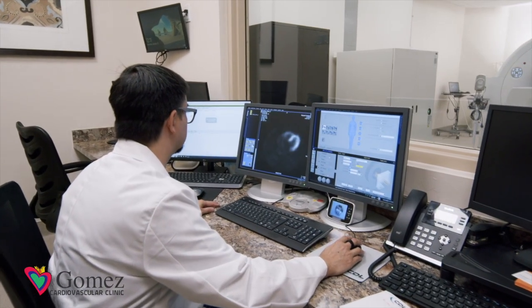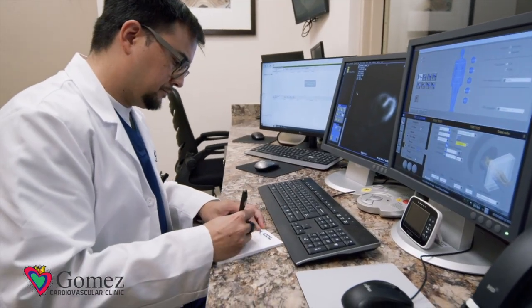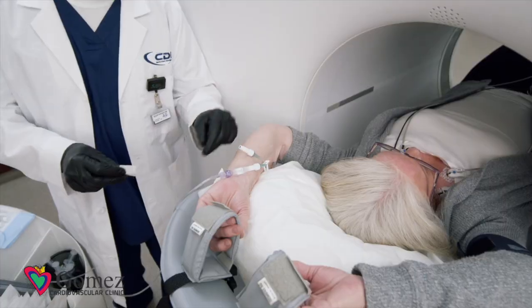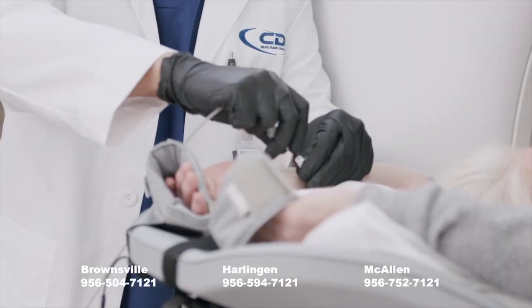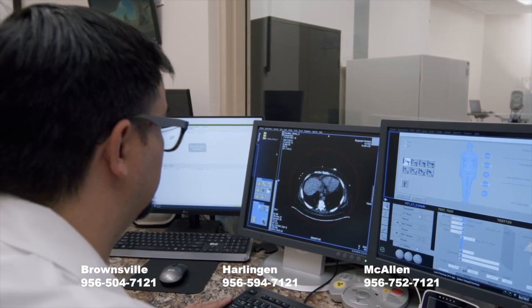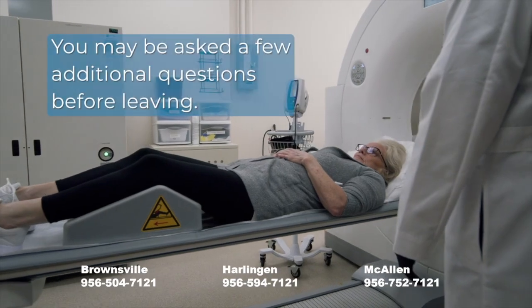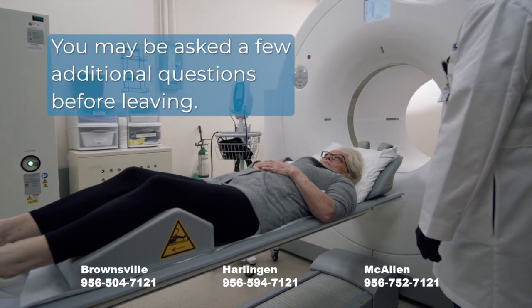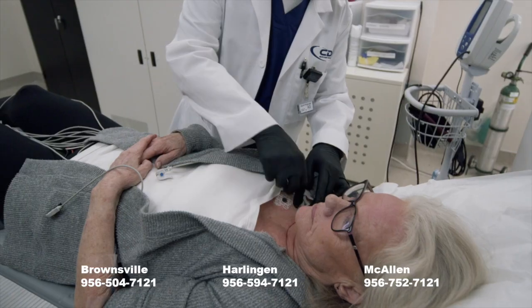This scan is a total of 7 minutes and is looking at the blood flow to the heart after stress or exercise. When the stress images are almost complete, the technologist will come into the camera room to disconnect the IV tubing so they can take a 2-minute CT image. Once all the scans are complete, your technologist will check to see if you have any lasting side effects. The table is then moved down and you are unhooked.